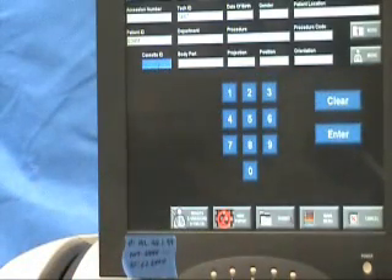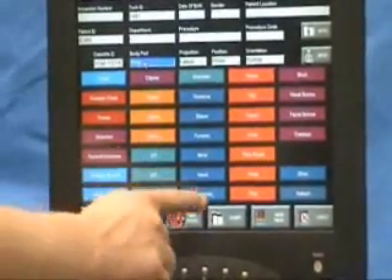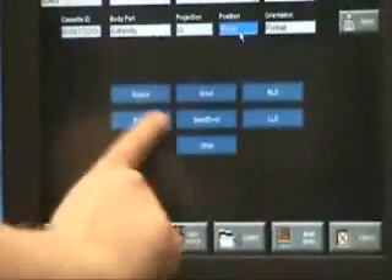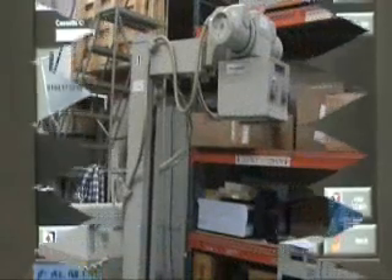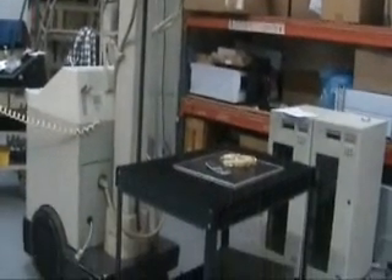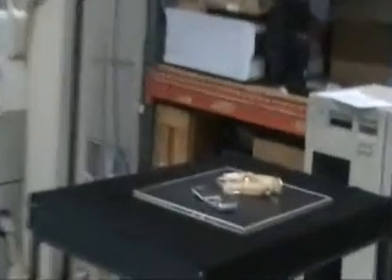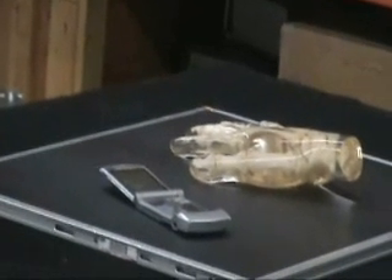We are going to take an X-ray as we normally do. Here we are just going to take an X-ray with an AMX-2 of a phantom hand and a cell phone.